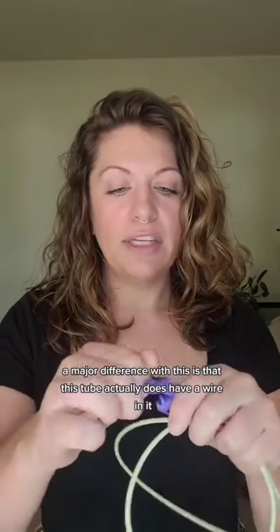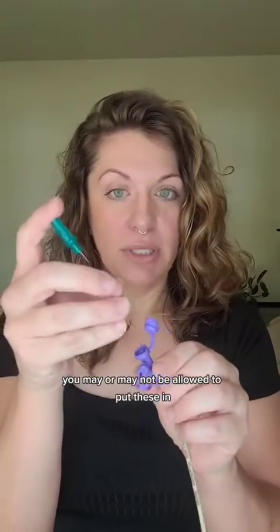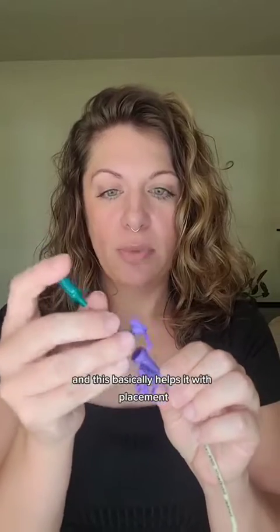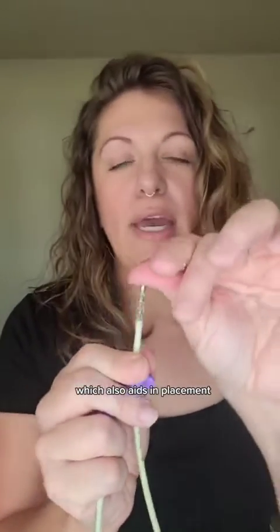Another major difference is that this tube actually does have a wire in it. Depending on where you work, you may or may not be allowed to put these in — it depends on your facility's policy and protocol. This wire has to be removed prior to usage; it basically helps with placement. Sometimes they actually will have a weight at the end — this one is a weighted one, which also aids in placement to get it to where it needs to go.